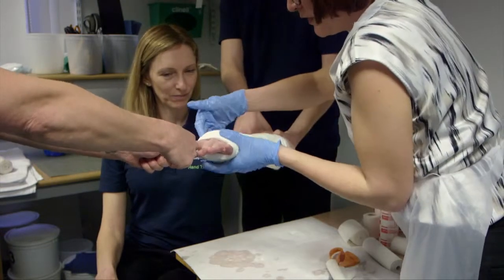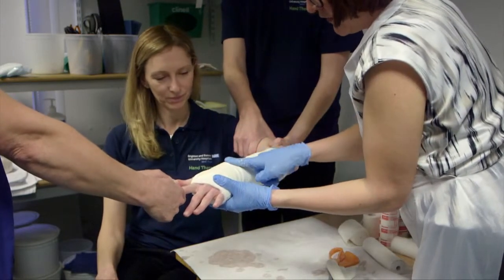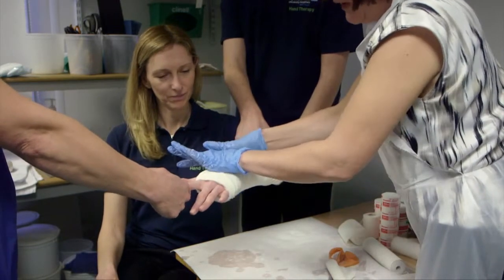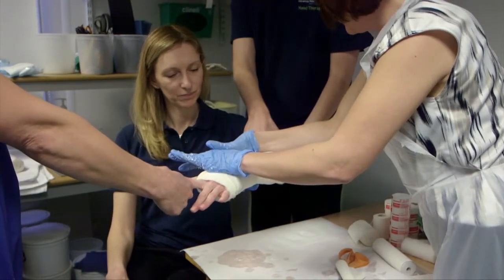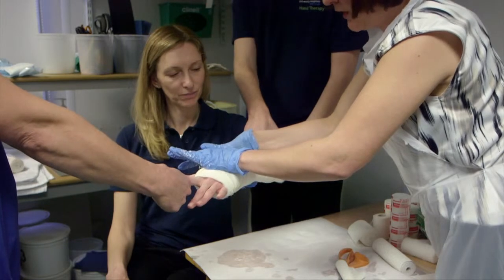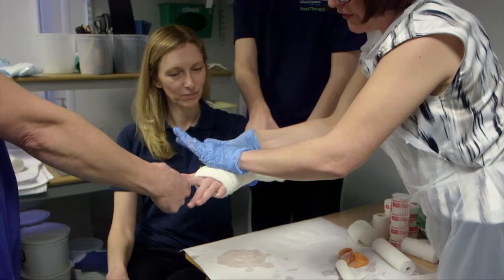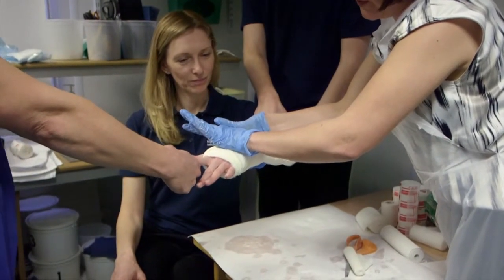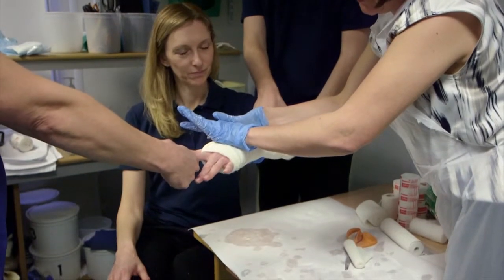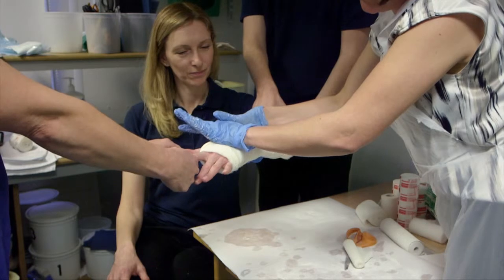This is the important part. The distal radius is here, the fracture is here, so your moulding must be here. We're holding the upper arm proximally, putting pressure on the volar aspect of the forearm proximal to the fracture, and then applying dorsal pressure at the actual site of the distal radius, just distal to the fracture. It's the three-point moulding that will reduce the fracture.